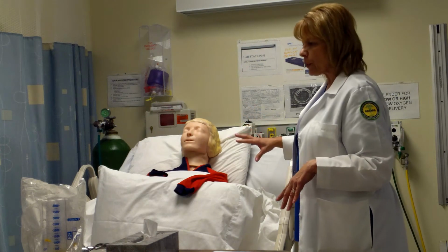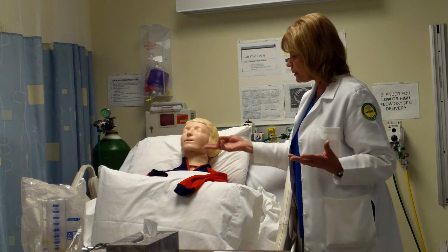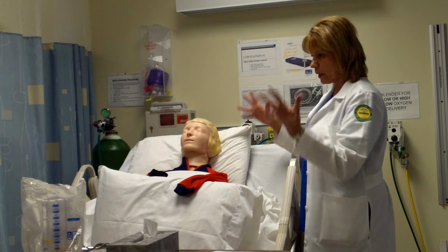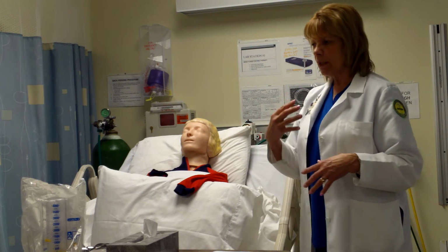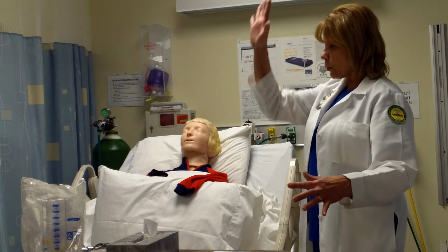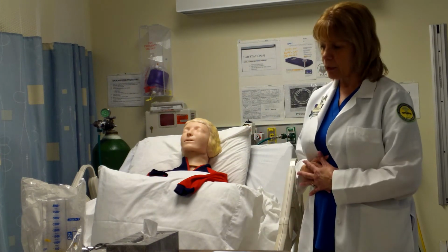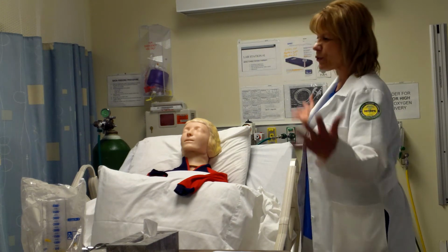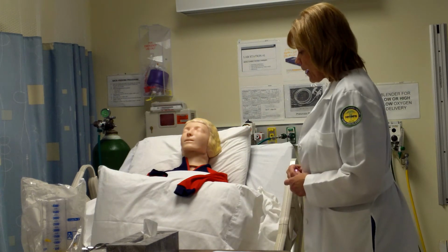Head, eyes, ears, nose, and throat. So I want to see that she can put a mouthpiece in her mouth and take the treatment through her mouth. Anything else that I would notice that would interfere with therapy, the neck comes next. And then it's pulmonary and cardiac, abdominal, renal, and extremities. So you just kind of work your way down the patient. In this particular case, the abdominal assessment is the incision. Probably isn't anything renal that I need to do. Extremities would be color and skin integrity, make sure she's not shocky or anything like that.